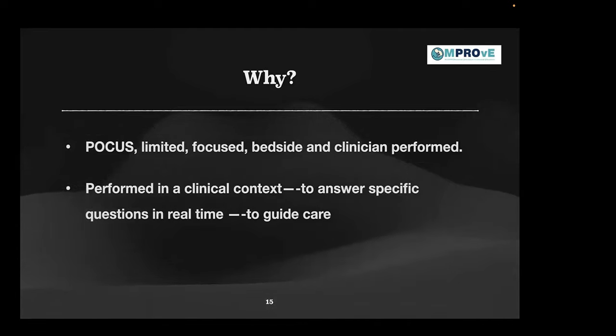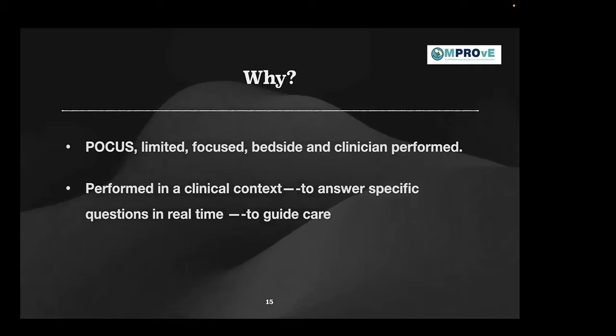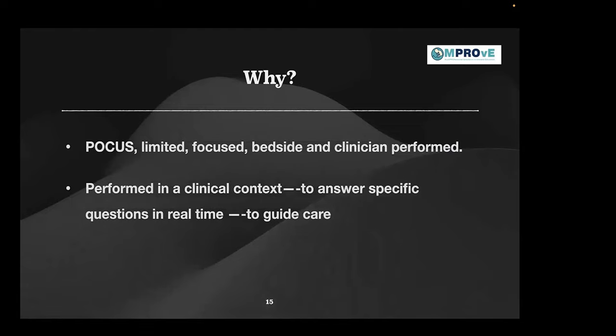So we are trying to find an answer to a very specific question when we are doing a point of care ultrasound, and so is the lung ultrasound as well. So it is always done in a clinical context, and I cannot emphasize it more. I think Alok has spoken many times about it. So it's all about the clinical context, the clinical background, because in lung ultrasound, you don't see lung, you only see the artifacts. And those artifacts can be generated in a wide variety of pathologies, in a wide variety of clinical conditions. So to correctly interpret those things in terms of the clinical scenario, you need to have a background of the patient or of the baby. So it's very important it is done in a clinical context.